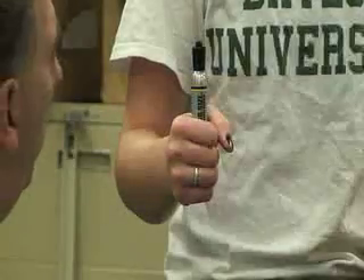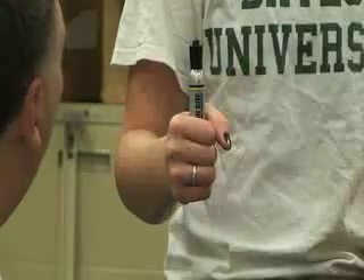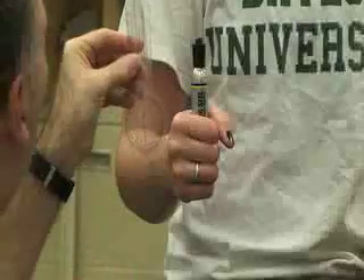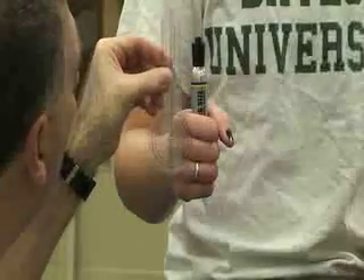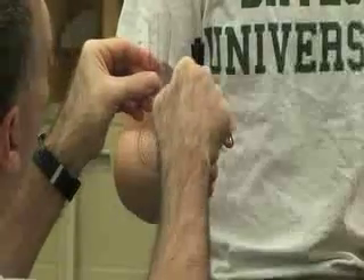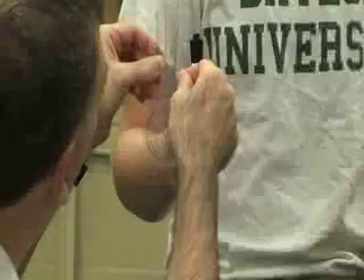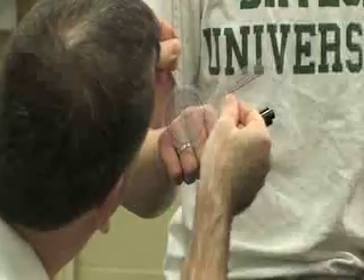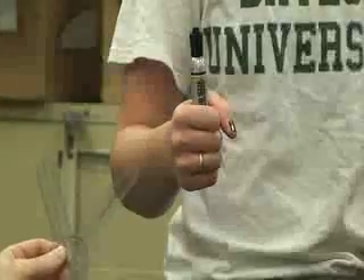Next we're going to do a goniometry measurement for forearm pronation. We're going to have her elbow flexed at 90 degrees at her side and we're also going to have her holding a pen or pencil in her hand in a closed fist. We're going to use a smaller goniometer for this. The fulcrum is going to be in line with the third metacarpal. The stationary arm is going to be perpendicular to the table or ground and the moving arm is going to be aligned with the pen or pencil. We'll have her go into pronation, making sure all landmarks are parallel and perpendicular to the floor. The average reading for this would be about 80 degrees.